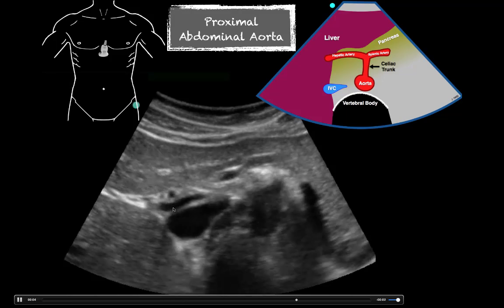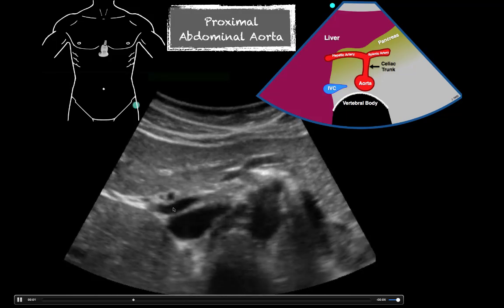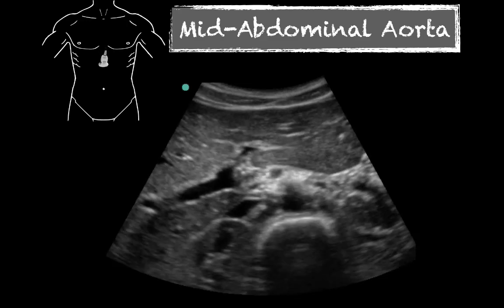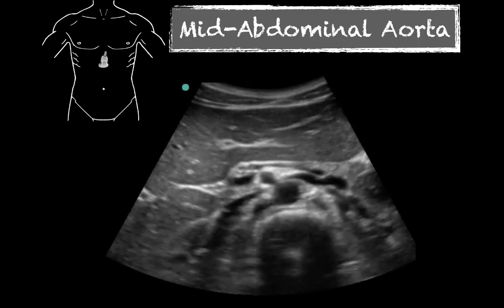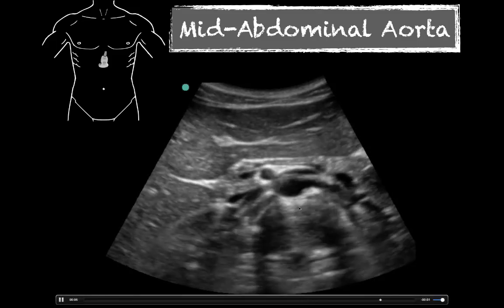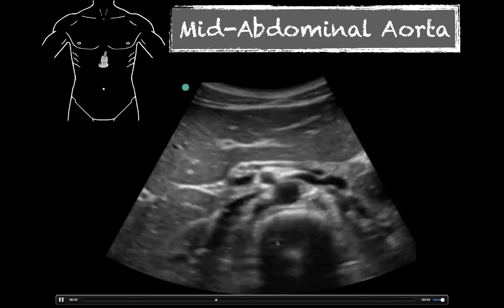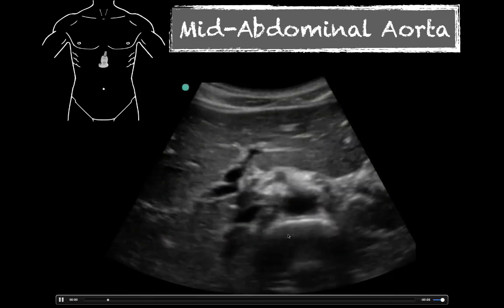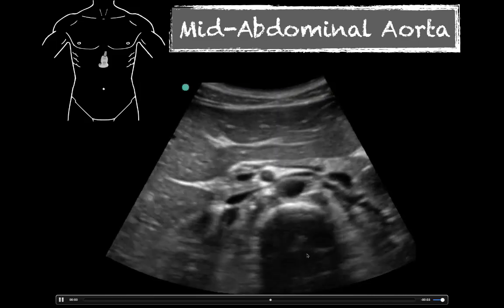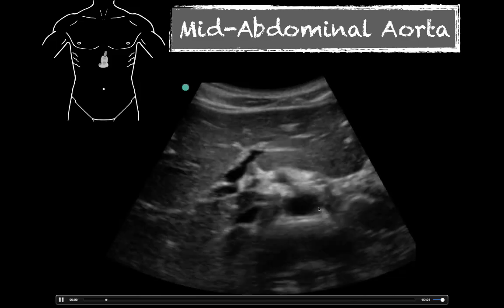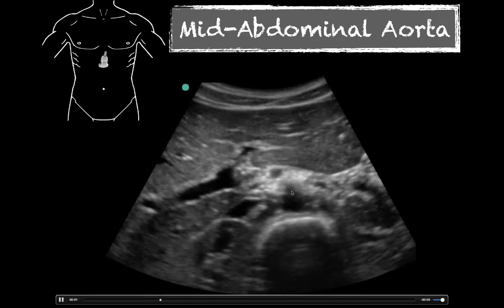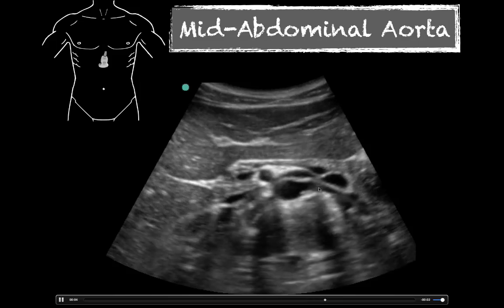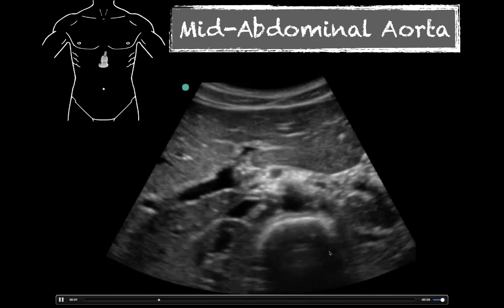The proximal and mid abdominal aorta transition happens quickly as you drag down, because you're going to hit the renal arteries. By definition the mid aorta is from the SMA down to the renal arteries. Here once again we have our vertebral body. You'll see a space because you're looking through an intervertebral disc — don't let that confuse you. Here's our aorta sitting right on top. Here's our SMA, and you can see that little branch coming off. Then we've got some vessels coming across, so let's look at that anatomy.